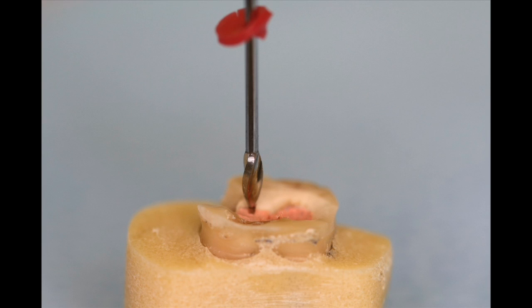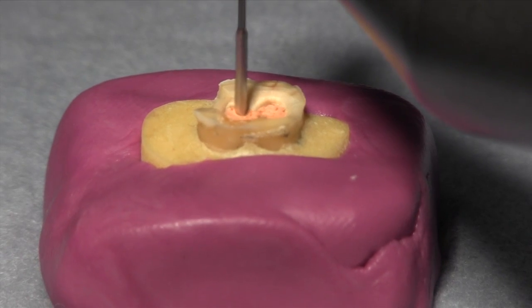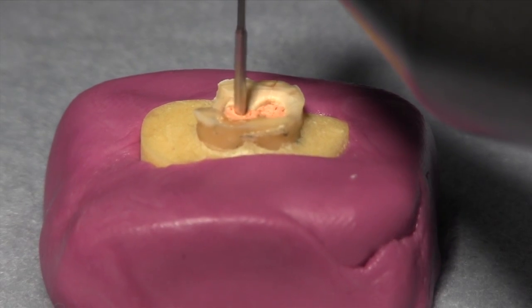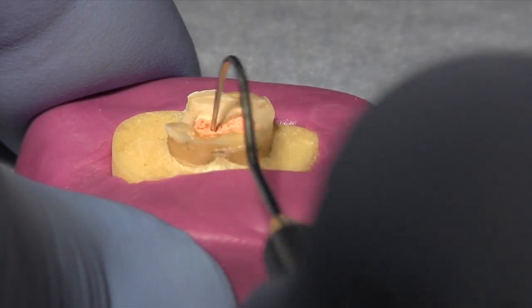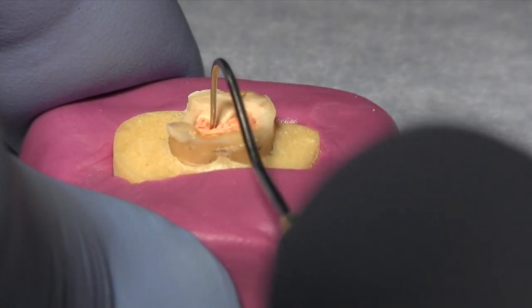The problem with non-end-cutting burrs is they don't start easily. If you put the tip on top of the gutta percha, they'll just spin until there's enough friction to melt the gutta percha, after which the side flutes will engage the filling material. An easier method is to begin with a hole in the gutta percha — make it with an explorer, deep enough so the flutes will engage, or use a small round burr to make a small hole in the filling material.